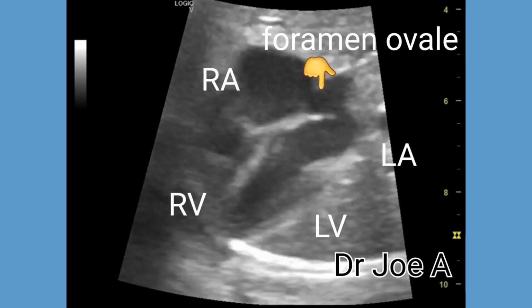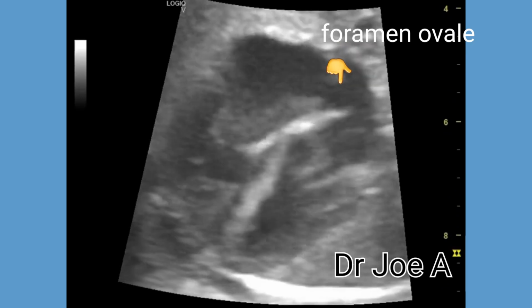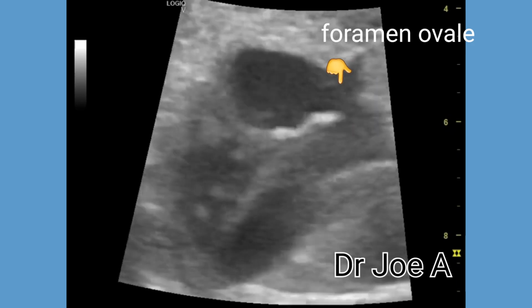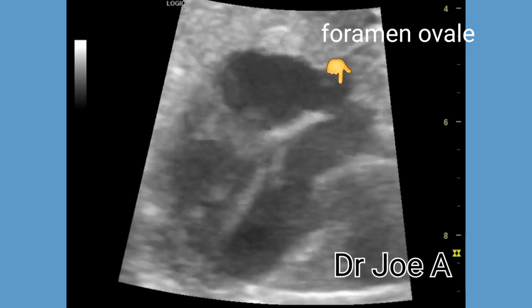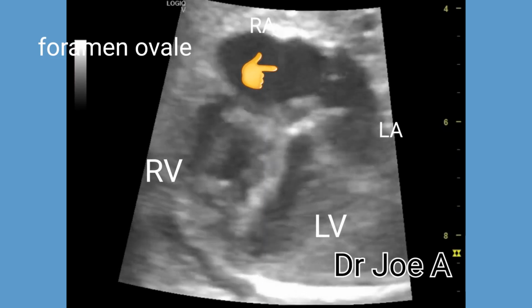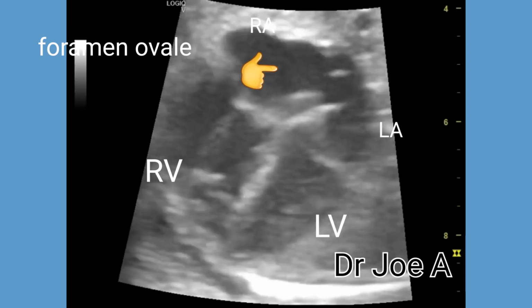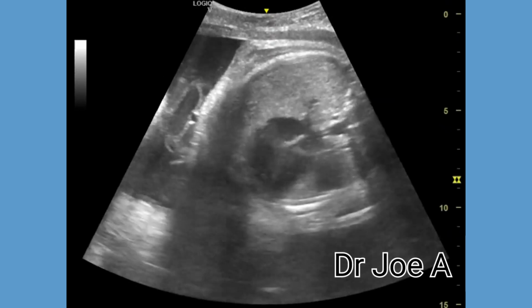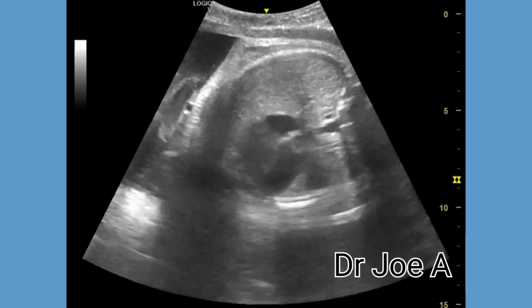The foramen ovale is a natural shunt by which oxygenated blood from the placenta reaches the ductus venosus, and from there it reaches the right atrium and bypasses the right ventricle to directly enter the left atrium via the foramen ovale. This ensures that vital structures such as the fetal brain receive maximum oxygenated blood from the placenta. The foramen ovale closes and seals the interatrial septum within a few months after birth.